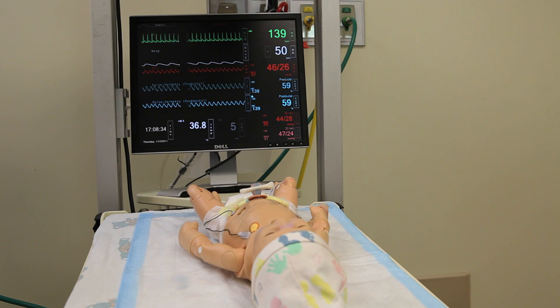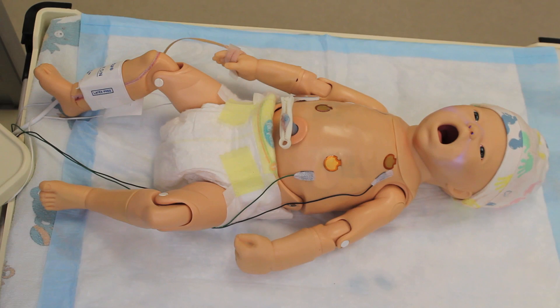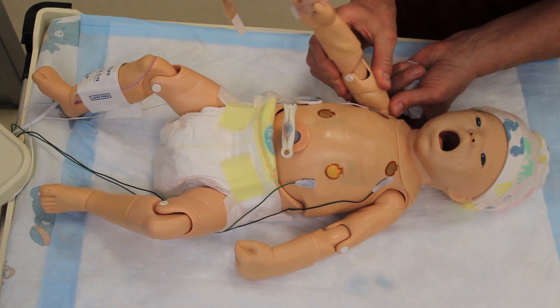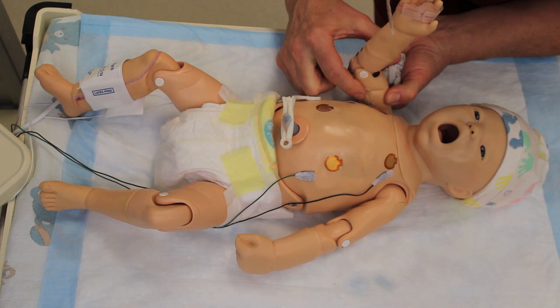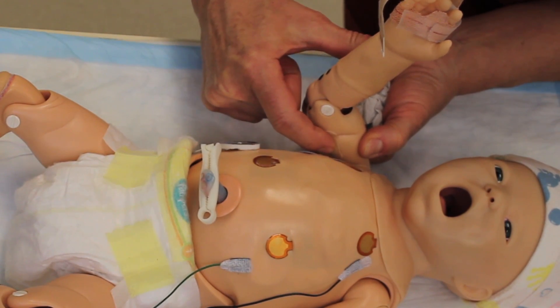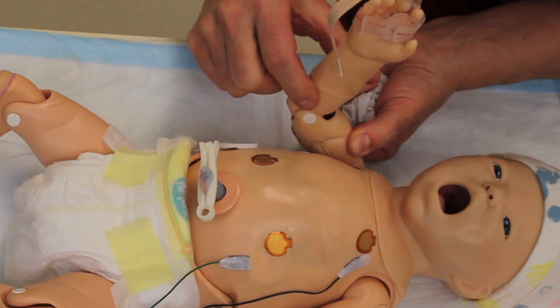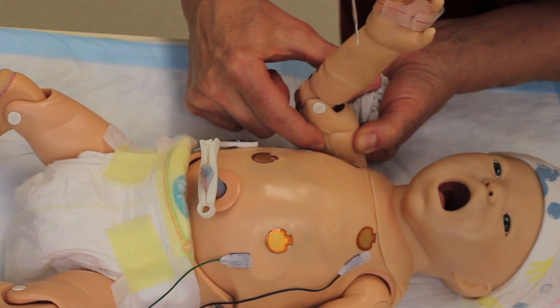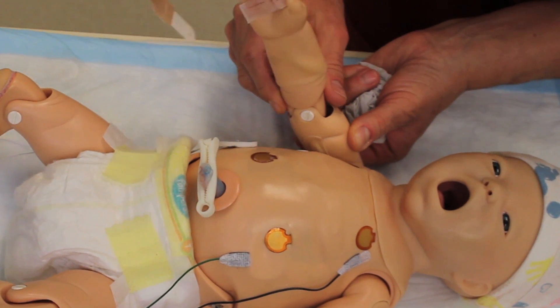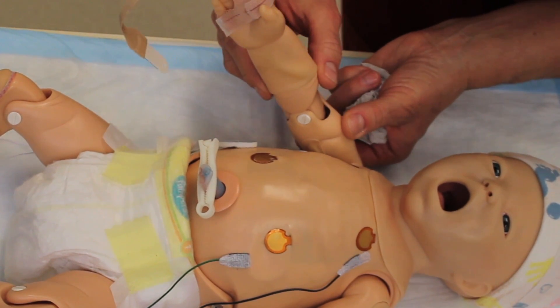Next, we're going to become aware of where the pulses are in this baby. This baby has brachial pulses on both sides. To feel the pulses, it's easier if you just lift the arm up a little bit and then palpate the little pads up near the armpit. If you press too hard, you will obliterate the pulse.